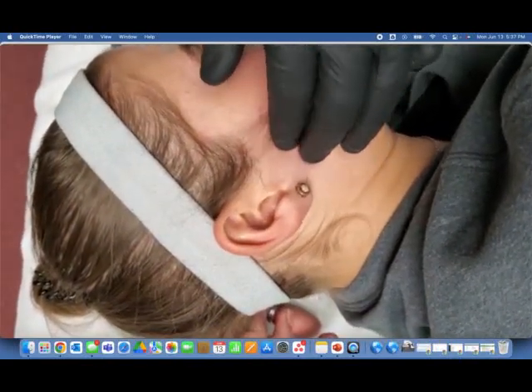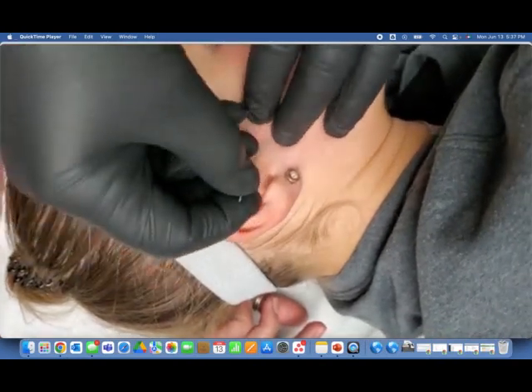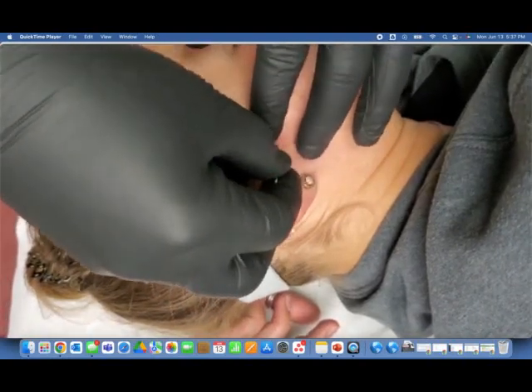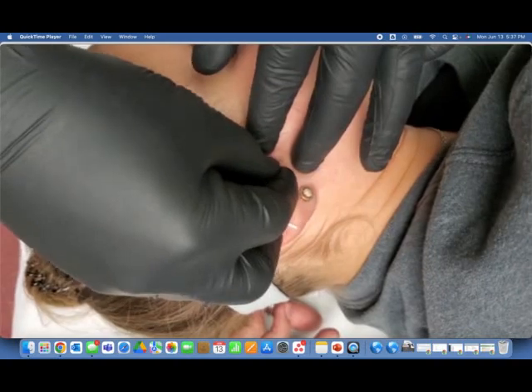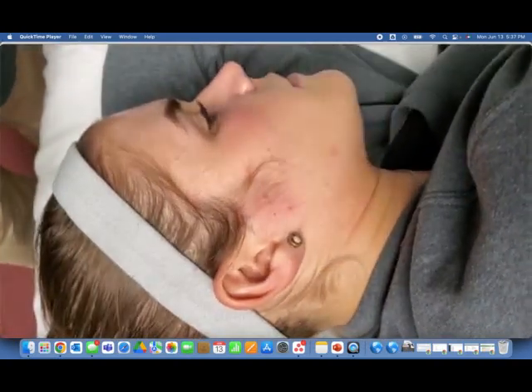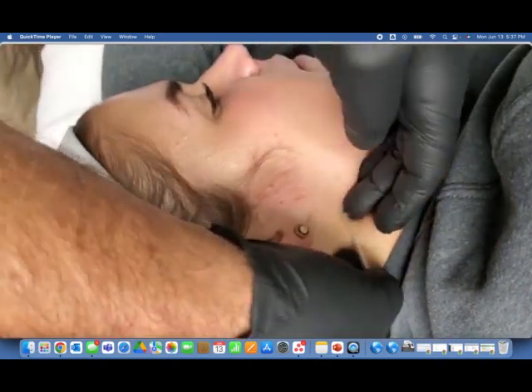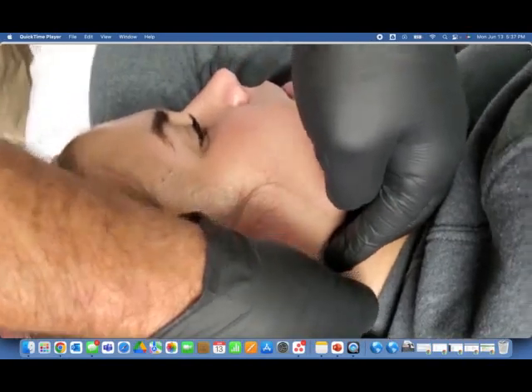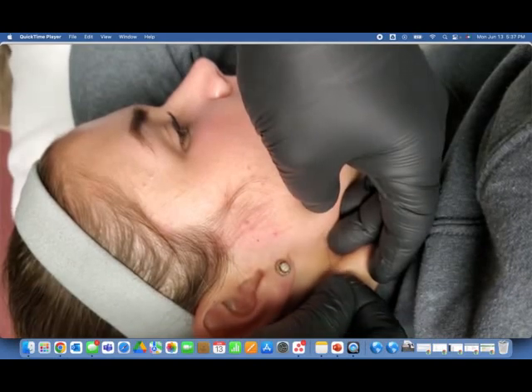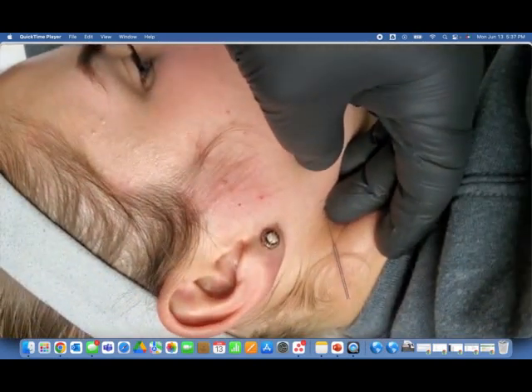So we'll look at that first approach. You're going to open the mouth, open that window up, and then taking that 4 to 5 centimeter needle, we're going to needle inferior to get into the medial pterygoid. As an alternative, which is what I tend to do a little bit more clinically, is finding that posterior angle of the mandible, and you almost have to lay that needle on the neck to needle in to land on that posterior or internal surface of the mandible itself.